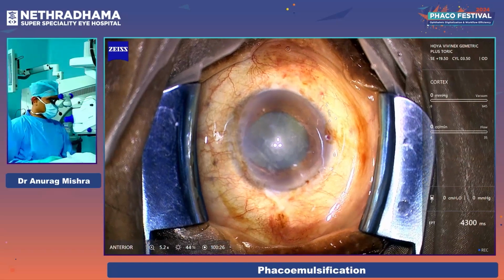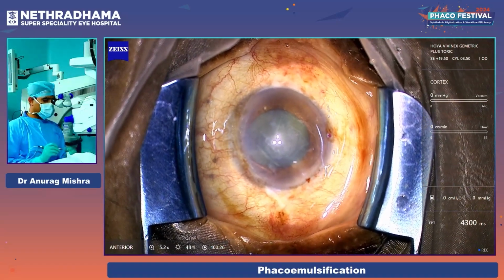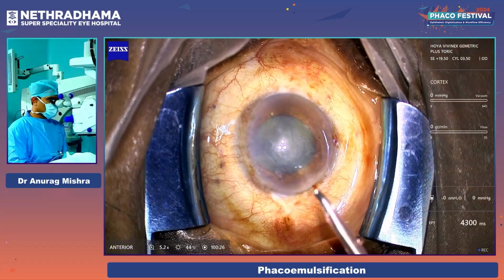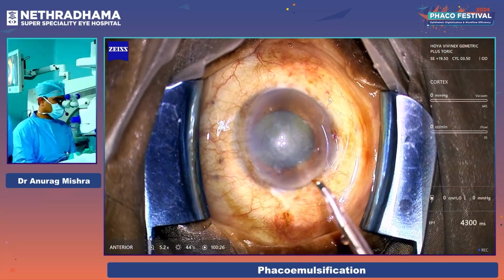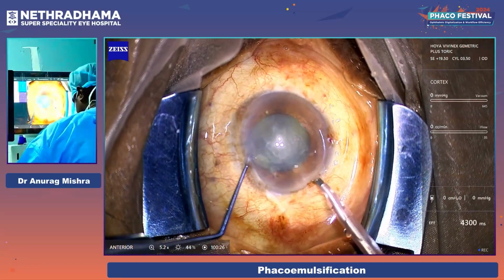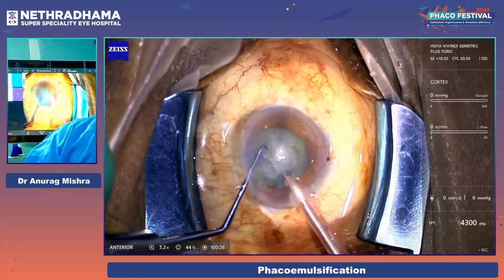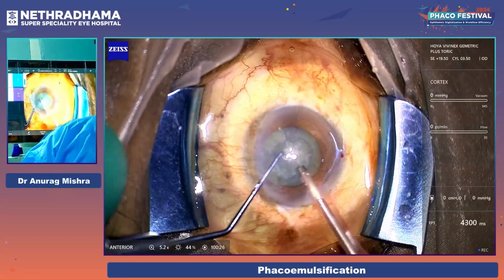Phaco handpiece, please. Just before we begin, just a short look at the parameters that I would be using for the surgery. The fluidics I generally use are pretty low. The IOP stays at 20, and that's across all grades of nuclei. I don't normally change my parameters based on the hardness of the nucleus. And the aspiration flow rate also stays low at 23, and the vacuum in the 450 range.